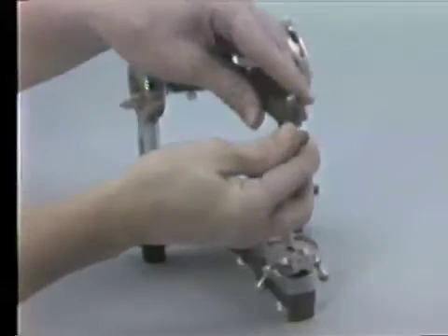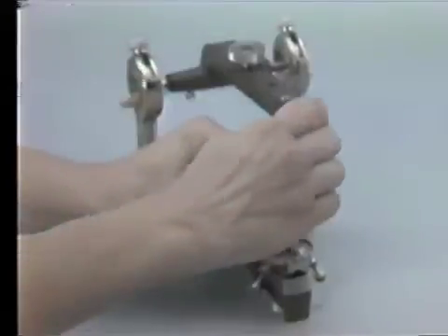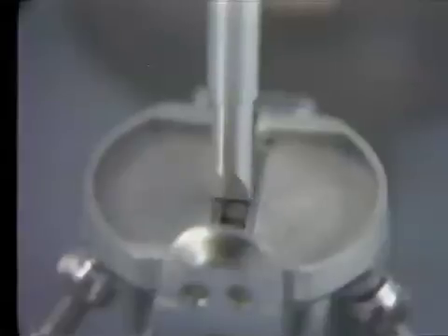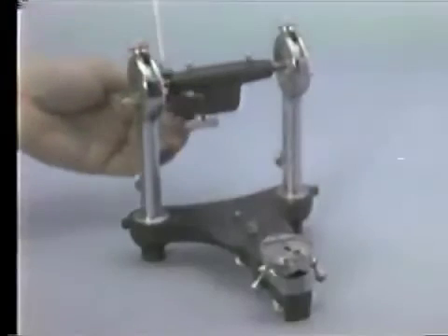The anterior-posterior setting of the incisal pin should be checked as follows. Loosen the thumb nut found on the front of the upper member. Slide the pin so its top is flush with the upper member, and position the pin so the thumb screw is tightened against the flat surface found on the upper part of the pin. Tap the pin attached to the upper member against the incisal table. Check the anterior-posterior setting of the pin with articulating paper. If the blue mark does not appear in the anterior-posterior center of the table, it may be due to manufacturing error, the pin may be long, the table too high, the centric stops not set at zero, or the pin may be bent.